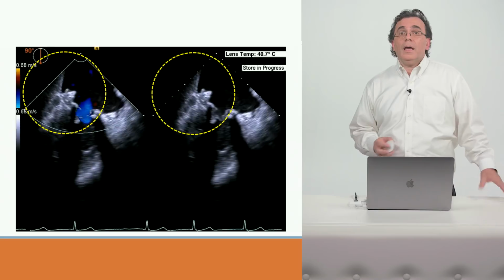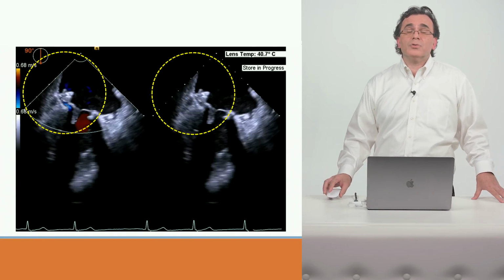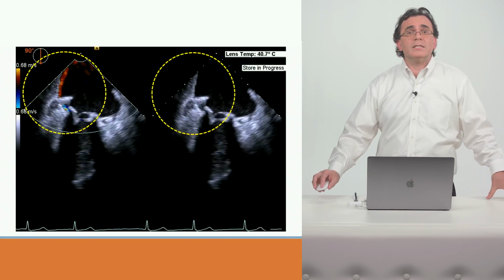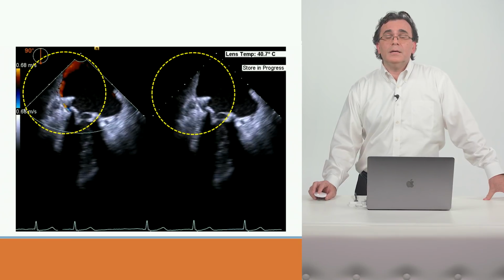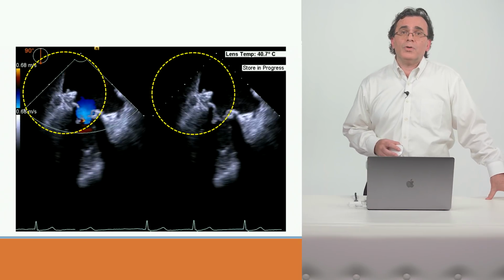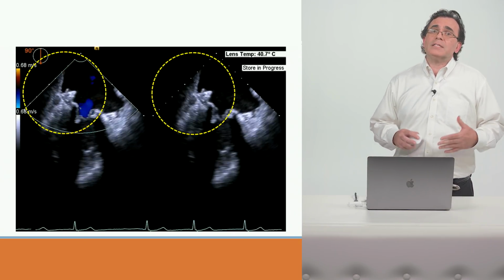And now we can turn on color to check if we have closed this leak. And it appears that there is a residual flow between the left ventricle and the left atrium. Now we can ask ourselves, was this a successful closure or not? So it's important to recognize that after placing the device, there will be continued flow through the device, and only after several weeks, when the device endothelializes, will there be complete closure. So this is essentially a satisfactory and successful closure of paravalvular leak, and the flow will stop in several weeks.